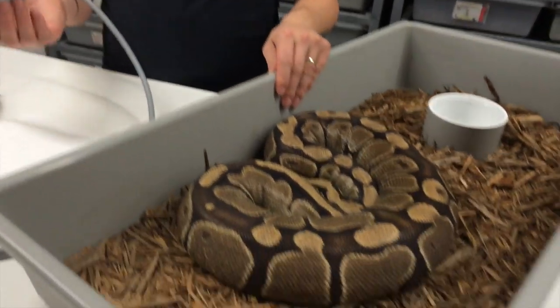Hey guys, this is part two of ultrasounding JKR pro tips. What we're doing is looking at some of the females from February — we're one month later. Last time we did January 23 or 24, now it is February 19. We're going to look at these females, look at the ones that had follicles last time, and see if we can find some new ones in females that are going a little bit later this season. I'm going to start out with number one girl.